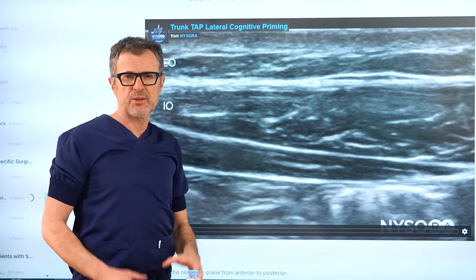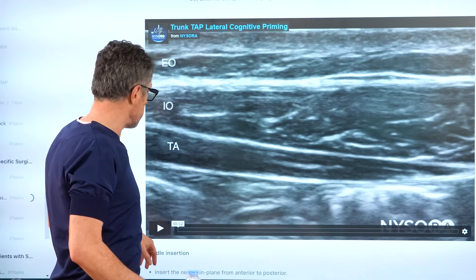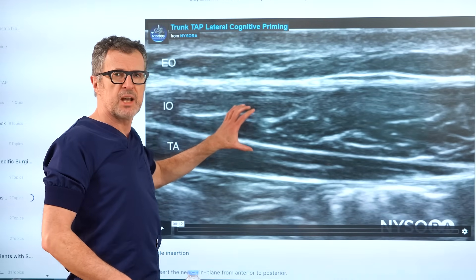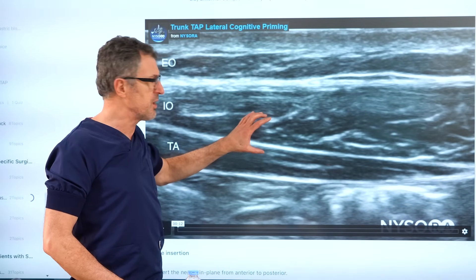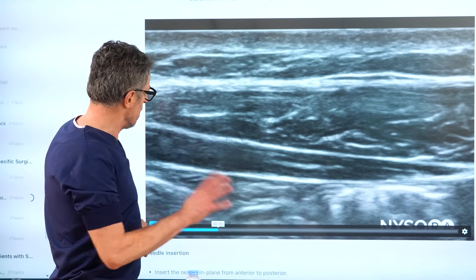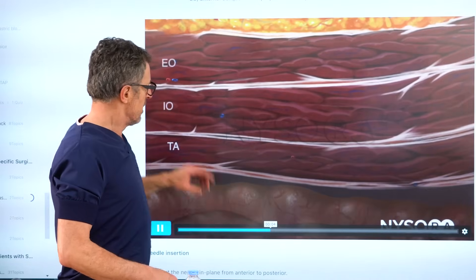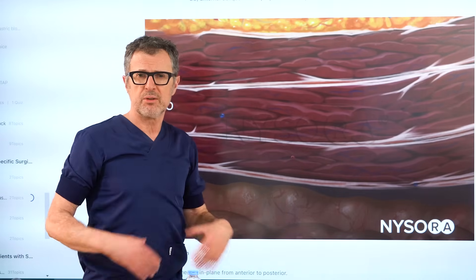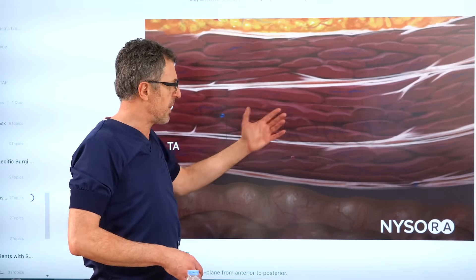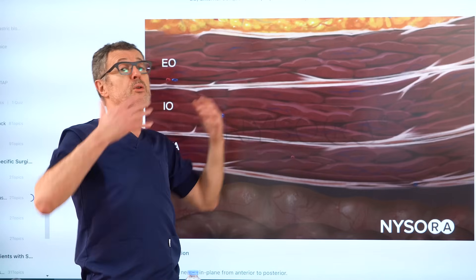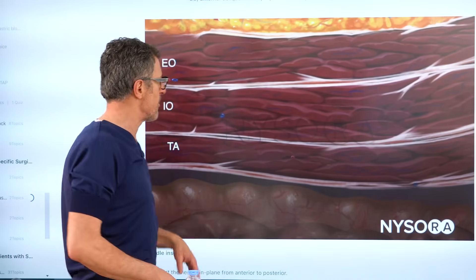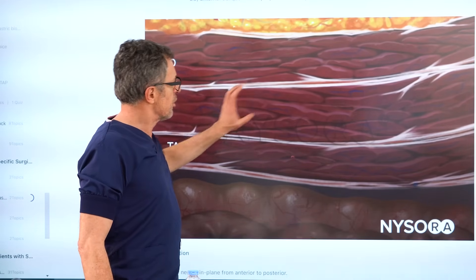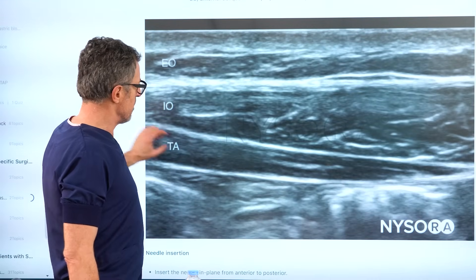This is NYSORA's reverse ultrasound anatomy animation. What we want to do with this animation is take the viewer from the ultrasound image during the lateral TAP block procedure into the illustration, so the viewer can ingrain these anatomical patterns. The next time you position a probe on a patient's belly, you can quickly recall those patterns and reproduce the images necessary for the TAP block. Here you can see how the illustration transitions into the ultrasound anatomy and back.